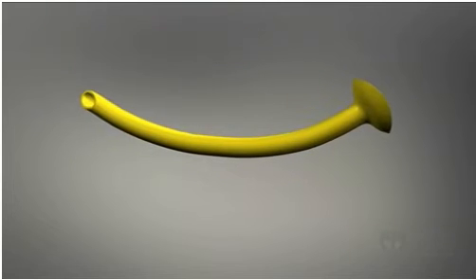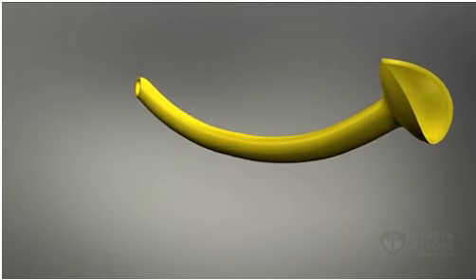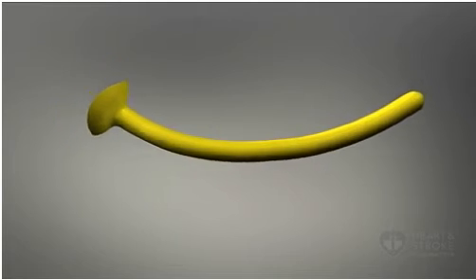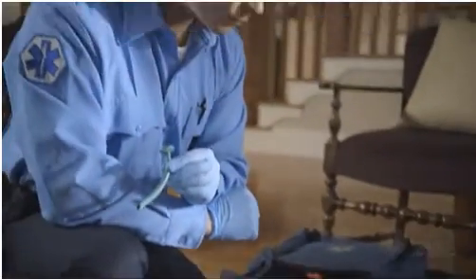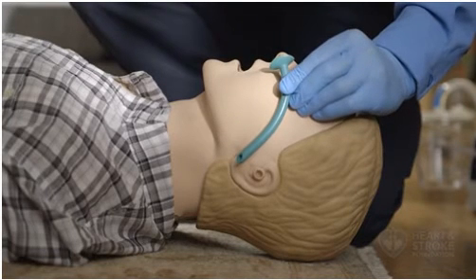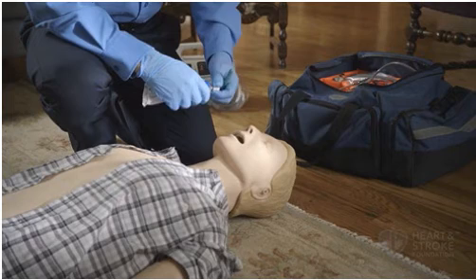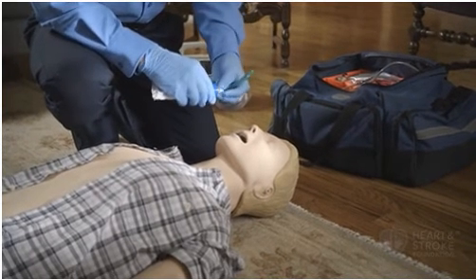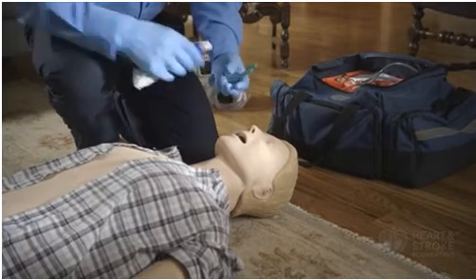The NPA is a soft, curved, hollow tube that can be inserted through the nostril to facilitate ventilation and suctioning. Unlike oral airways, NPAs may be used in patients who are conscious, semi-conscious, or unconscious, with or without a gag reflex. In choosing the correct size, make sure that the length of the NPA is the same as the distance from the tip of the patient's nose to the earlobe. Before inserting an NPA, lubricate the airway with a water-soluble lubricant or anesthetic jelly.